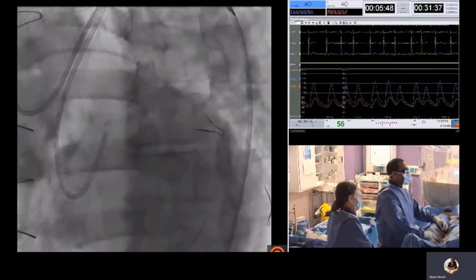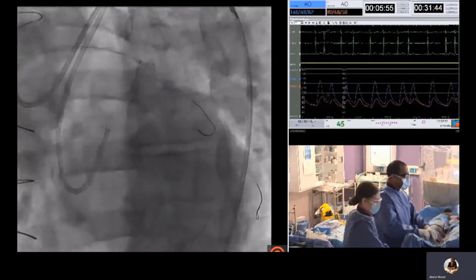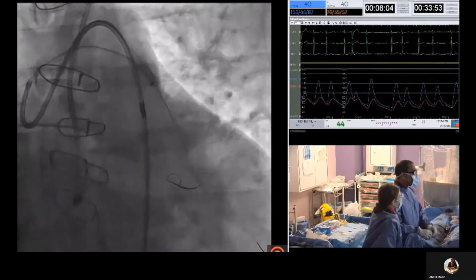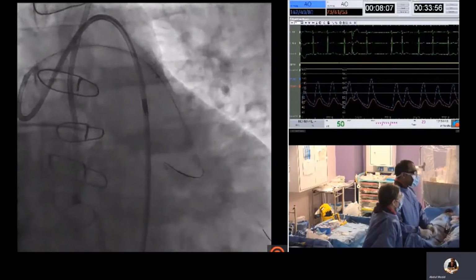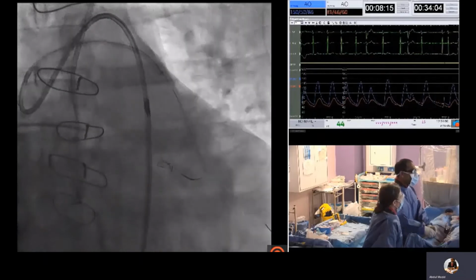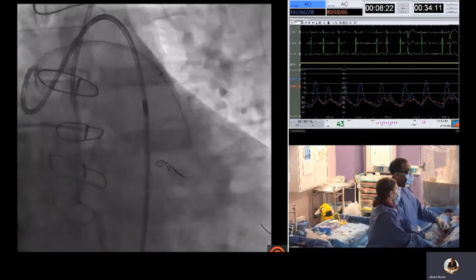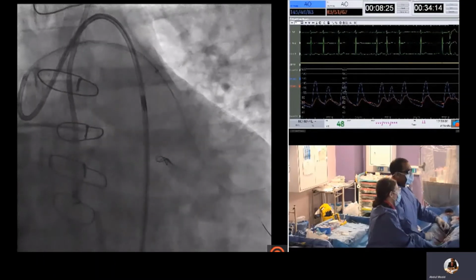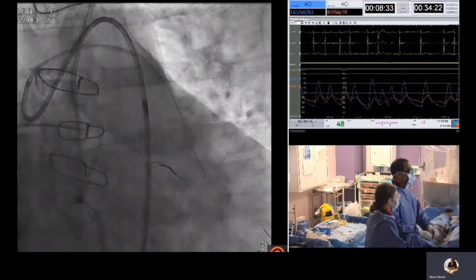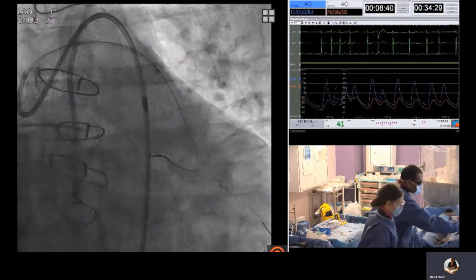Other tricks to try and overcome such acute angulations are to use angled microcatheters such as the Supercross 120. Here, having managed to get into proximal circumflex, the aim now is to blunt dissect to the proximal cap, and we do this using a knuckling technique. So this is a Pilot 200 wire folded over, accessing likely the subintimal plane and being pushed safely in the subintimal space. This is a much safer way of crossing ambiguous anatomy rather than trying to wire with stiff wires.